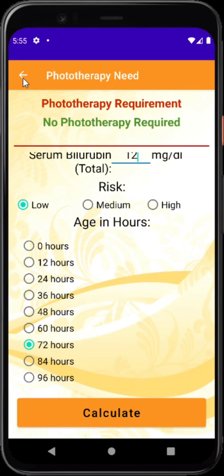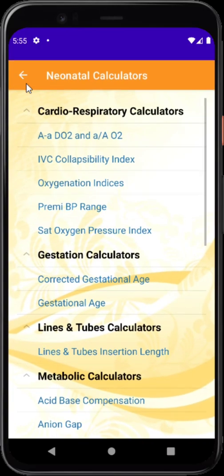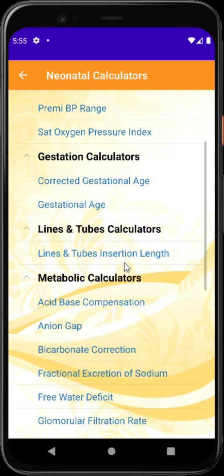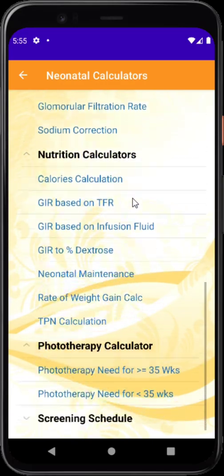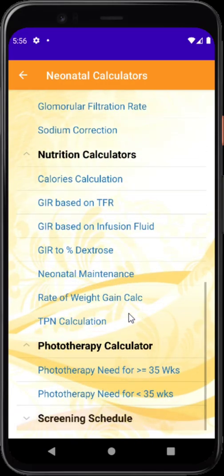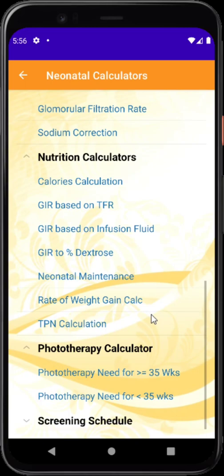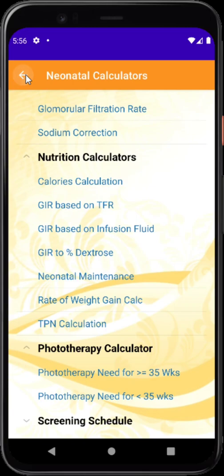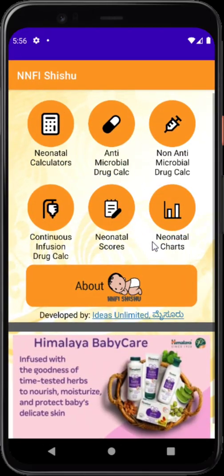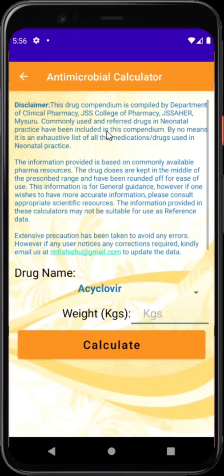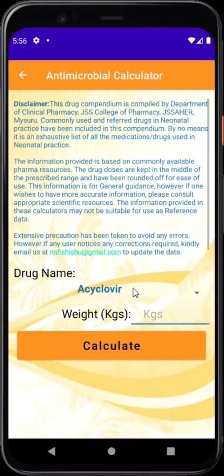For babies less than 35 weeks, there is another chart based on NICE guidelines which will be discussed later. This is followed by drug calculation, where we have antimicrobial drug calculators.